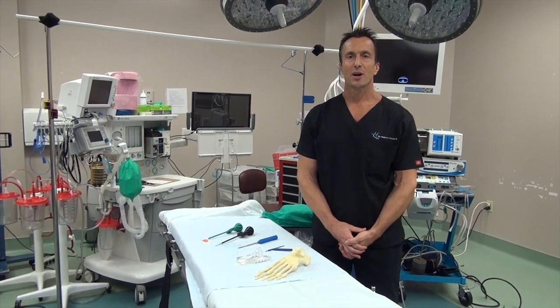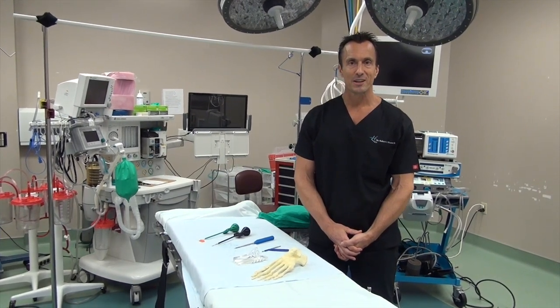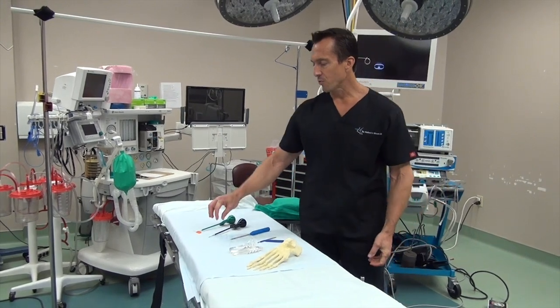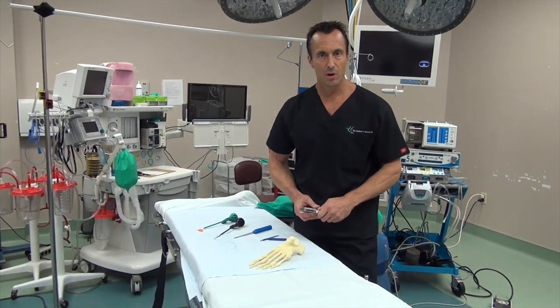Hi, this is Dr. Moore discussing today a new medical device from the company Arthrex called the internal brace. The internal brace is a fortification of the anterior talofibular ligament that's performed with a procedure called the modified Broström.